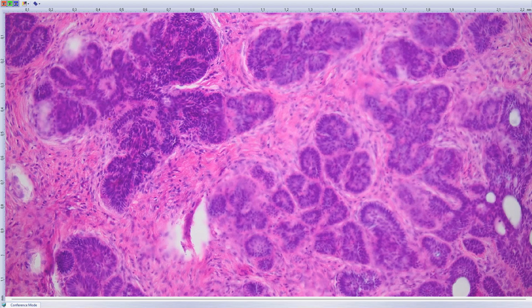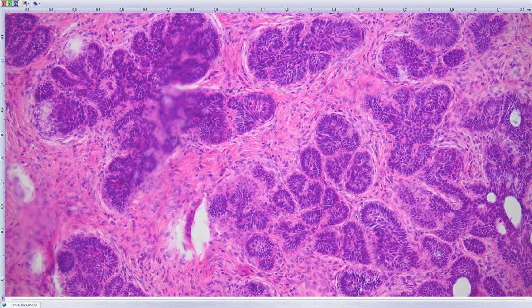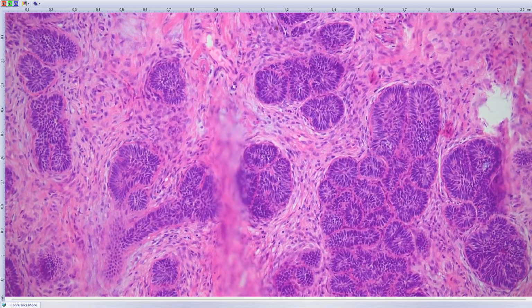We do not distinguish here trichoepithelioma from trichoblastoma. According to Ackerman, who was the last one having a very strong opinion, he distinguished these two tumors, said that trichoepithelioma was more superficial, trichoblastoma deeper. I think that the difference is very subjective and impossible to apply to most of the cases. So we mostly call this trichoblastoma in this department.